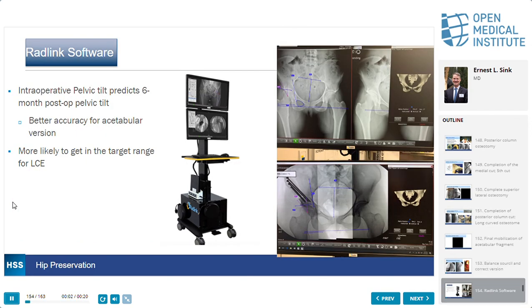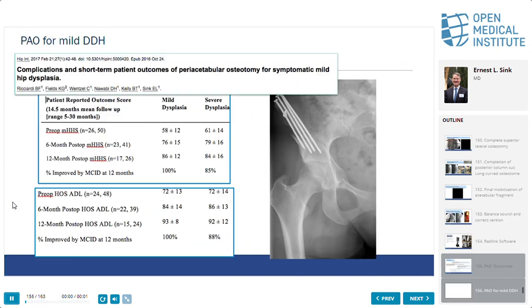Now we analyze. Does anybody who does total hips use navigation at the end to tell where it is? So we now can measure all these indices intraop, which tells me exactly where the hip is, which I think has been a big factor and has really helped.